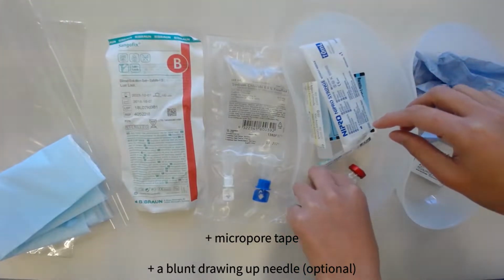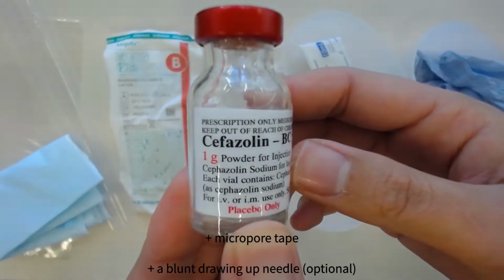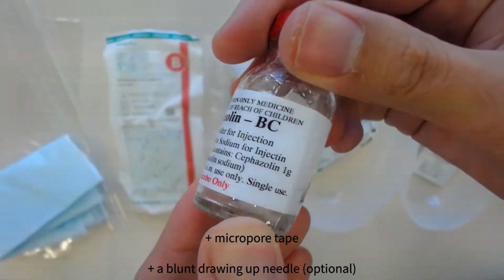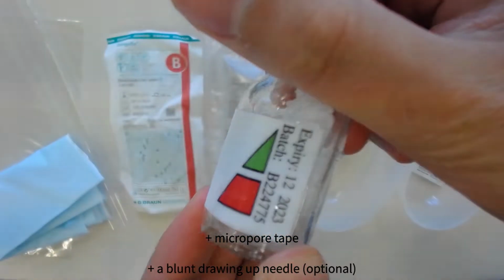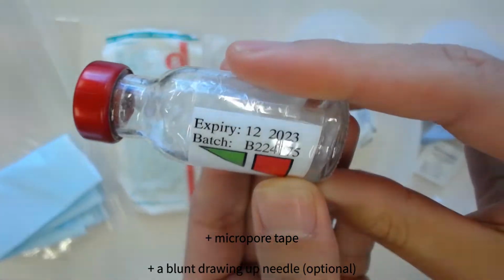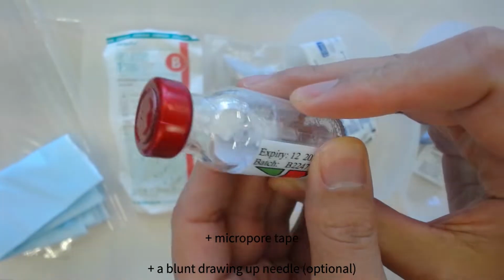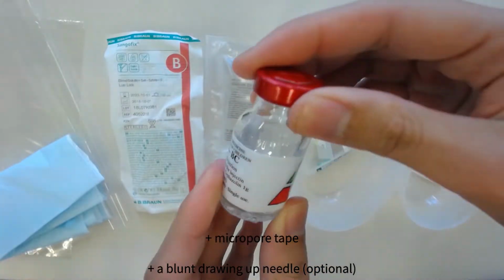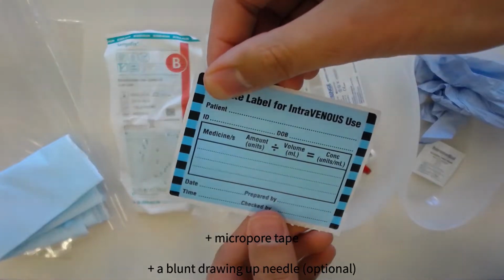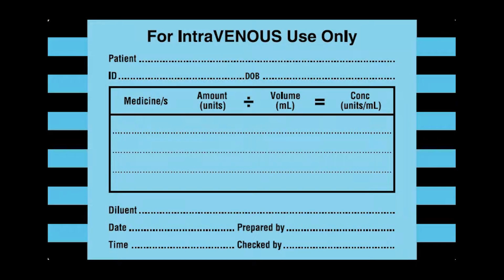Here is my medication, and I can see that it's Kefazoline 1 gram for IV use. And I'm checking the expiry date here. So I've checked the expiry date of both my diluent and my medication. That's the top lid. Here is my blank IV additive label. And later in the video, I will show you a completed label.